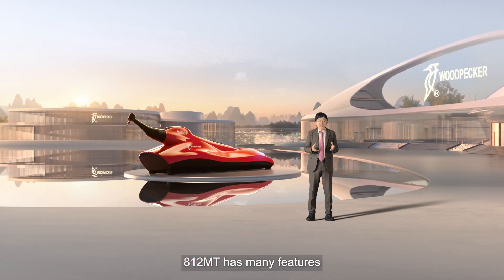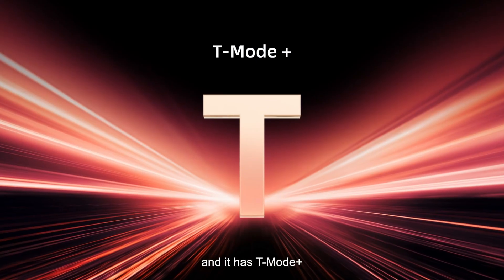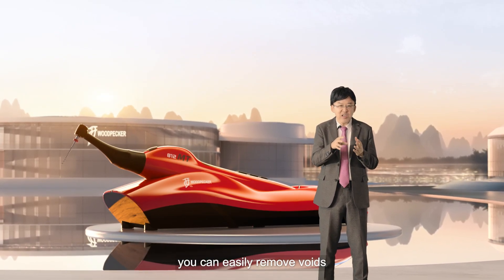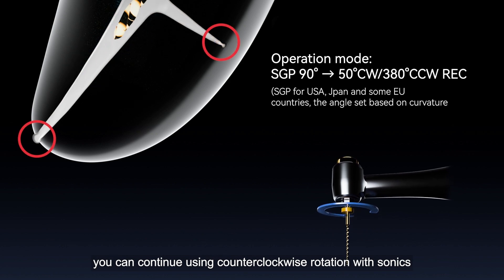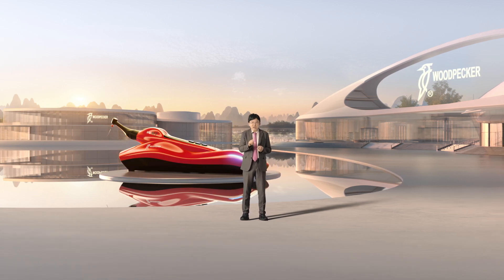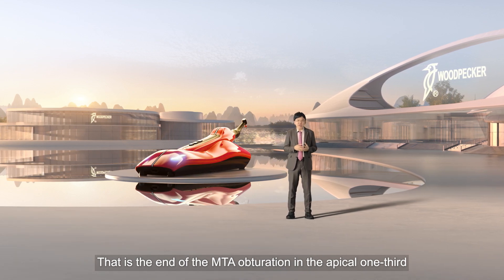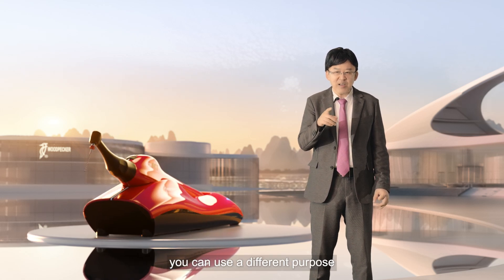812 MT has many features: sonic vibration and T-Mode Plus. If you get voids, you can use clockwise rotation with sonics to easily remove them. If you don't have voids, you can continue using counter-clockwise rotation with sonics, then use a small up-and-down motion until you see the reading going from apex to 0.5. That is the end of MTA obturation in the apical one-third. With T-Mode Plus, you can use it for different purposes.